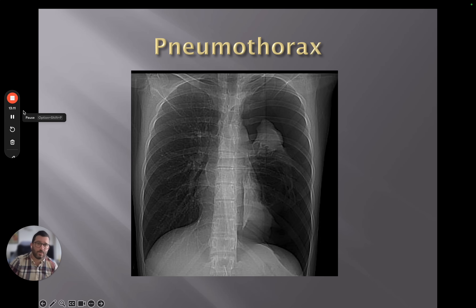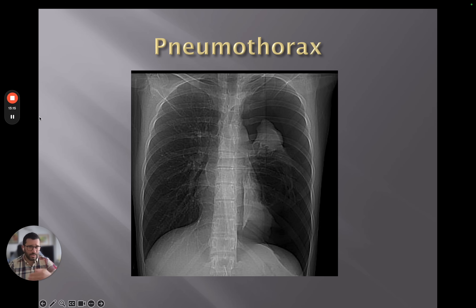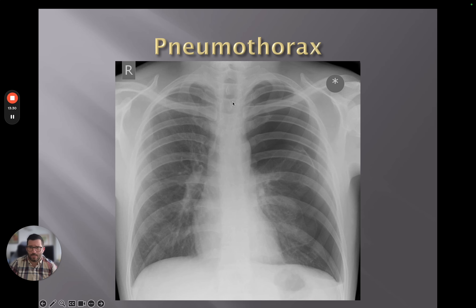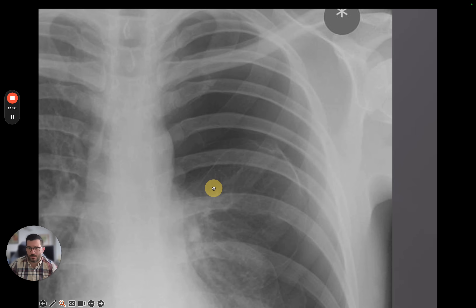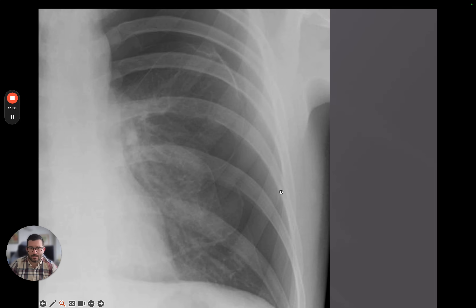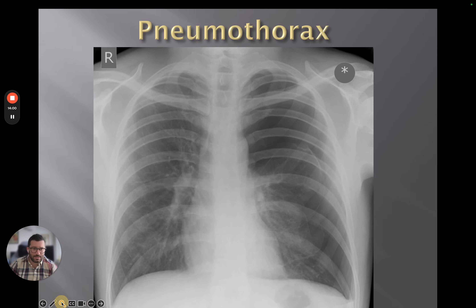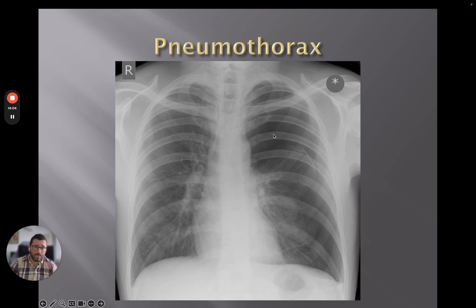A very common pathology is pneumothorax — a collapsed lung or air within the thoracic cage where it shouldn't be. This example from a CT scout shows a very abnormal left hemithorax with pretty much complete collapse of the left lung. On a chest x-ray it can be very obvious: we've got the visceral pleural edge, and then nothing beyond it — no lung markings all the way down — this is all air. The right hemithorax looks very normal.